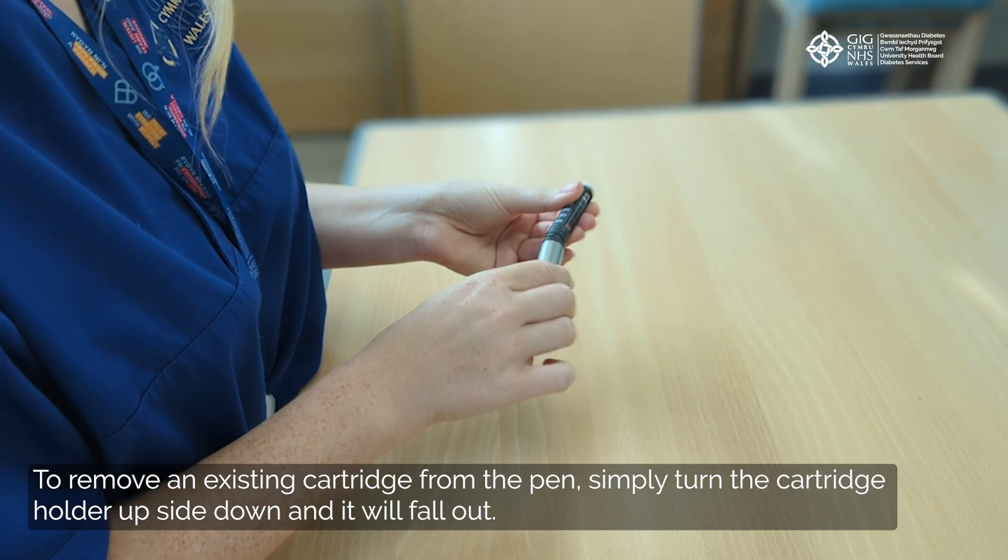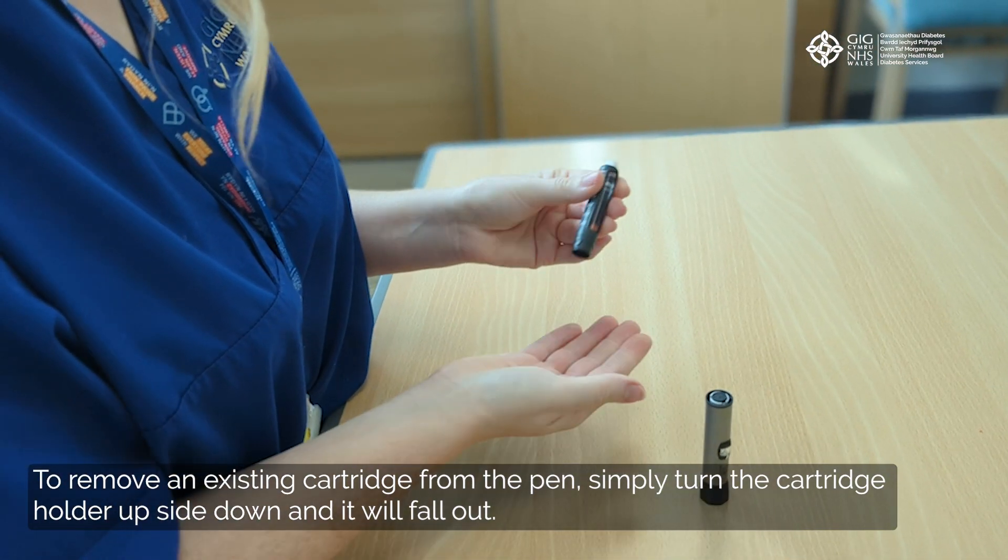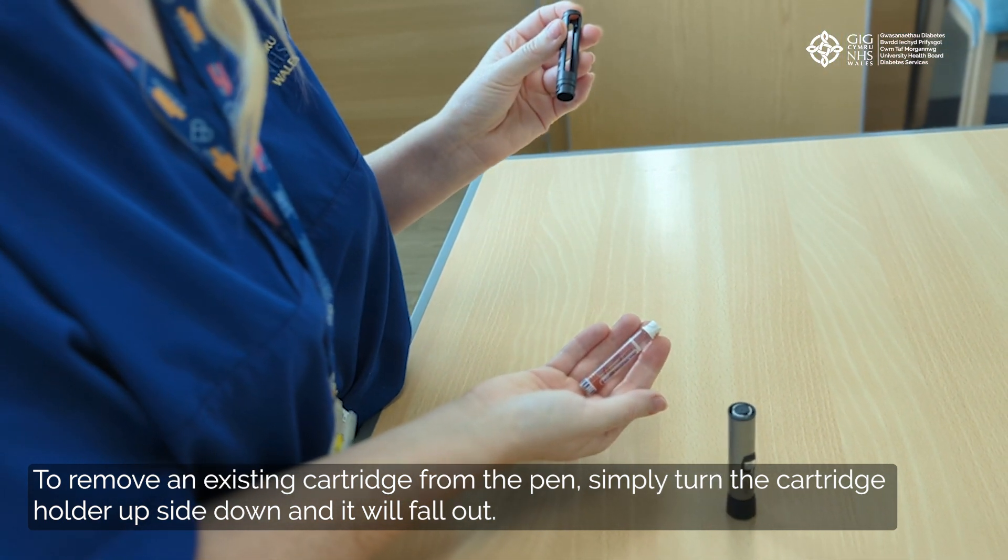To remove an existing cartridge from the pen, simply turn the cartridge holder upside down and it will fall out.